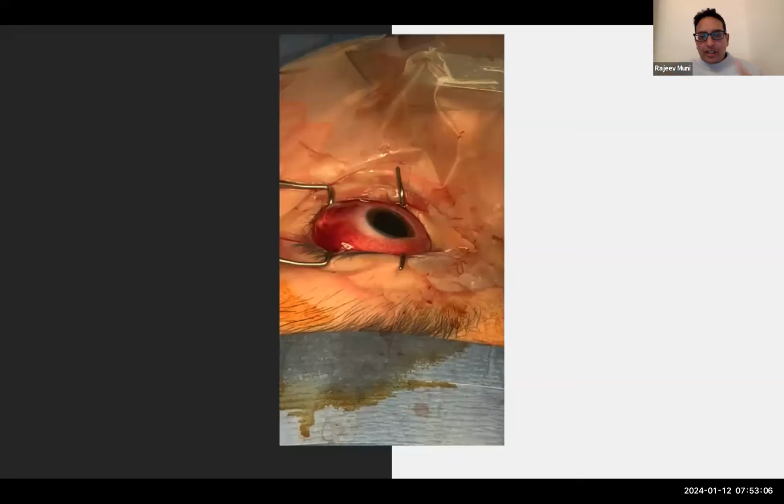But yeah, as you go through this, you don't want to tear the conjunctiva and end up having these huge openings anyway. So it's really practice, and how to handle the tissues. It does take a little more time, for sure, and a little more care. But our question is, is it worth it?